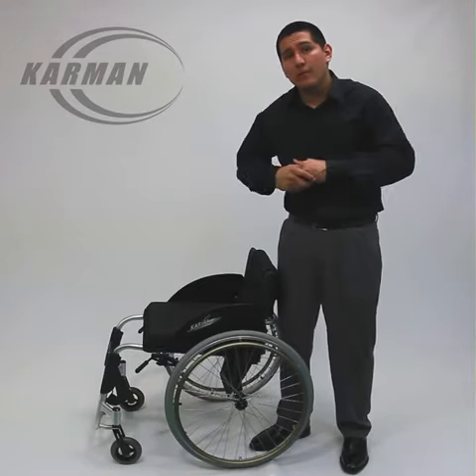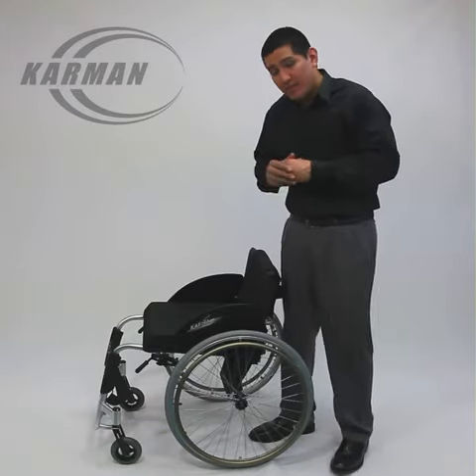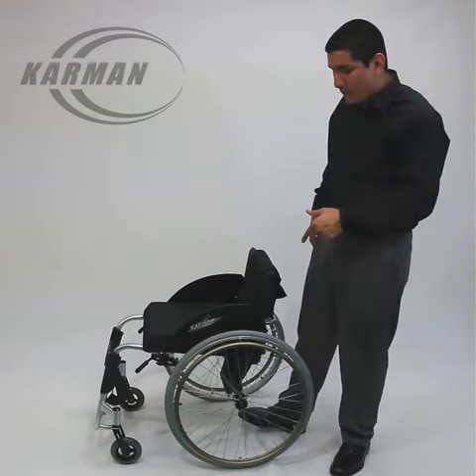This chair is meant to make you independent, not rely on a caretaker or a loved one to propel yourself. This comes standard with your 24-inch spoke wheel.